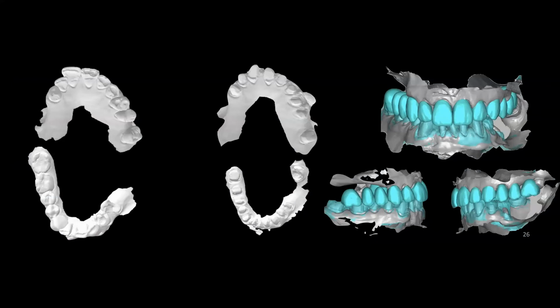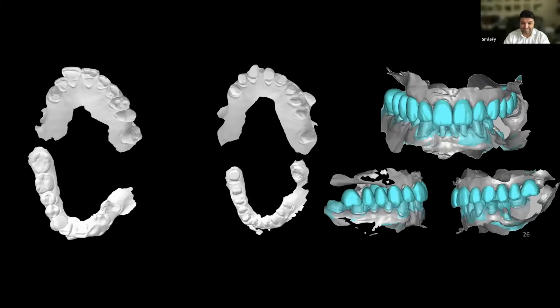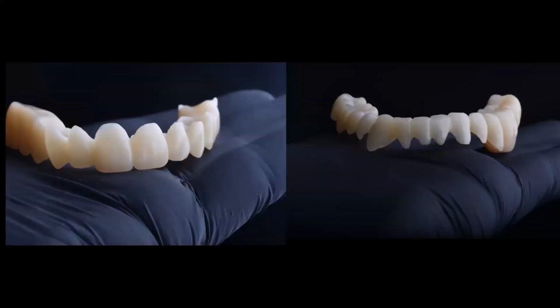Second step is the project, 2D, then 3D. Second appointment, in this case, I milled all the patient's teeth and created this.